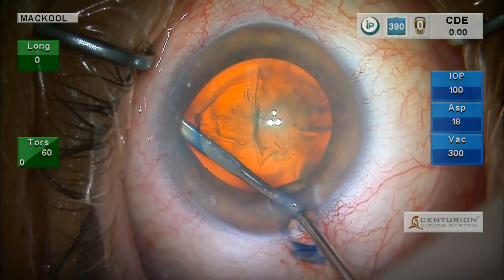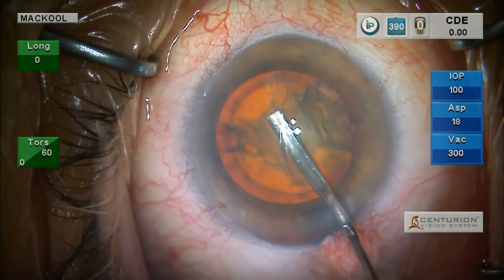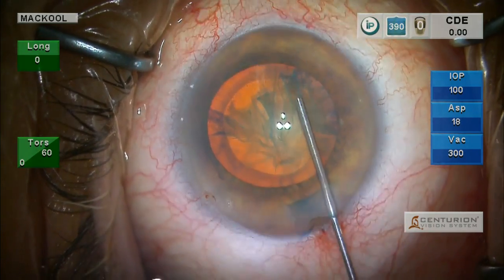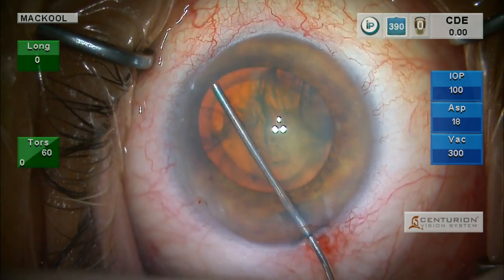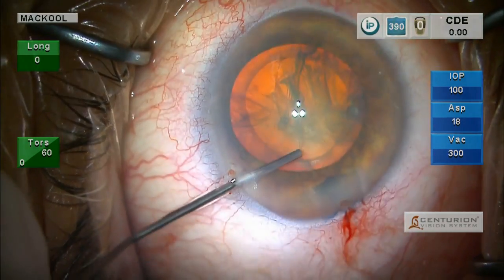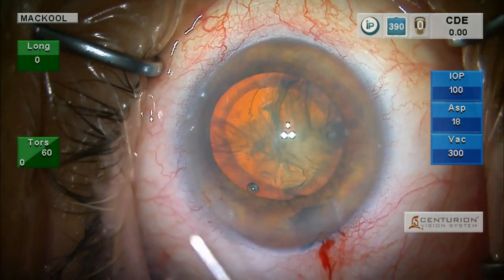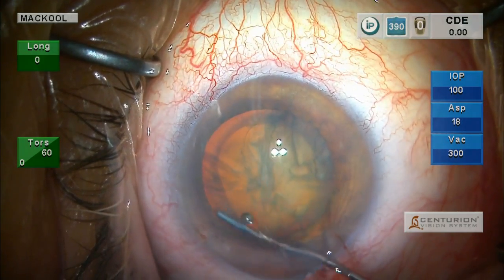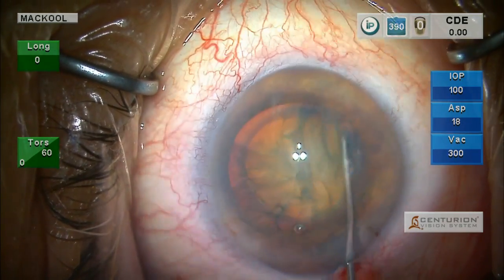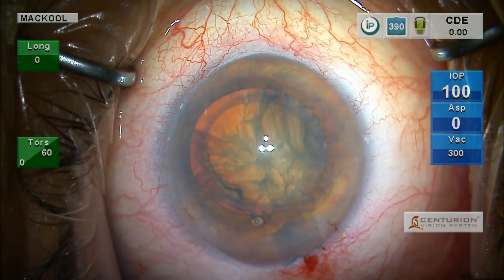Flat 23-gauge cannula, lift up capsule, inject. Same thing on the other side, depress the nucleus. We want a zonule-friendly technique, and we especially want one in eyes with pseudoex or any eye that might have a lax zonule. Here I'm injecting viscoat 360 degrees under the capsule, creating what I like to call a nuclear sandwich, and that acts to keep the capsular fornix in position.